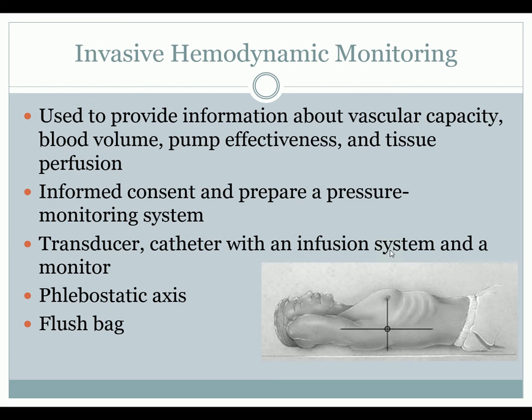All right, so now what we're going to be talking about is hemodynamic monitoring.